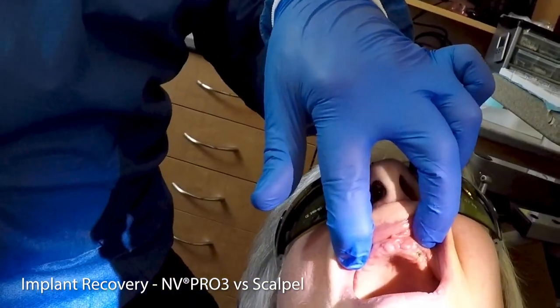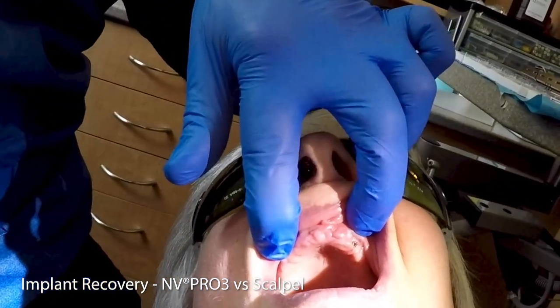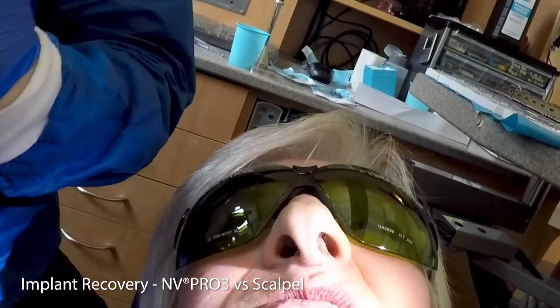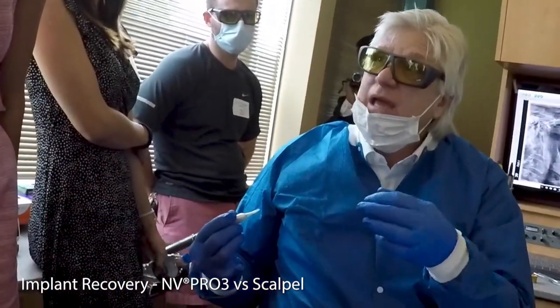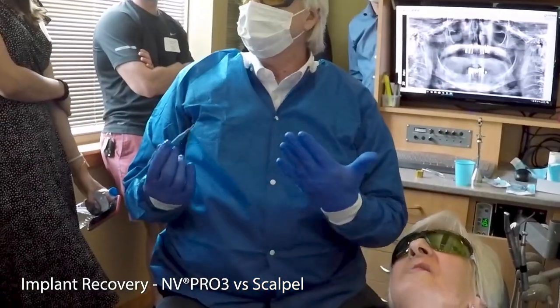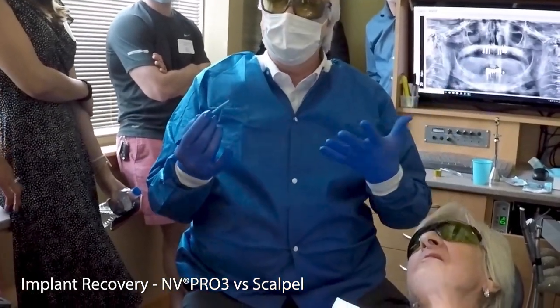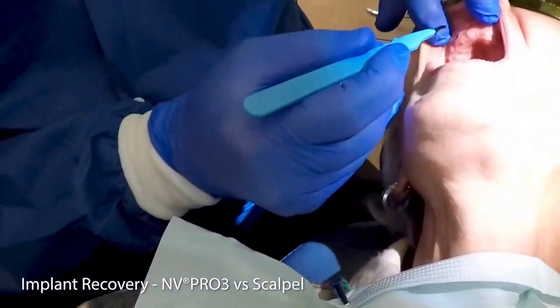Is it bleeding? No — pretty amazing with just topical. Was it bad? If you put the energy high and it starts to char, you're creating more energy and it's going to cut deeper — that's when you start to feel it. Use your judgment; sometimes the tissue is really thick. Now versus the more standard way of uncovering — I know most of you don't do implants, but if you're uncovering, we're going to do this one over here.